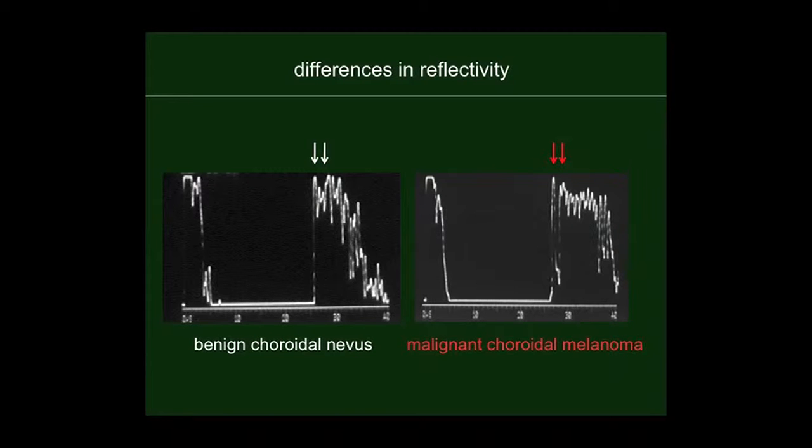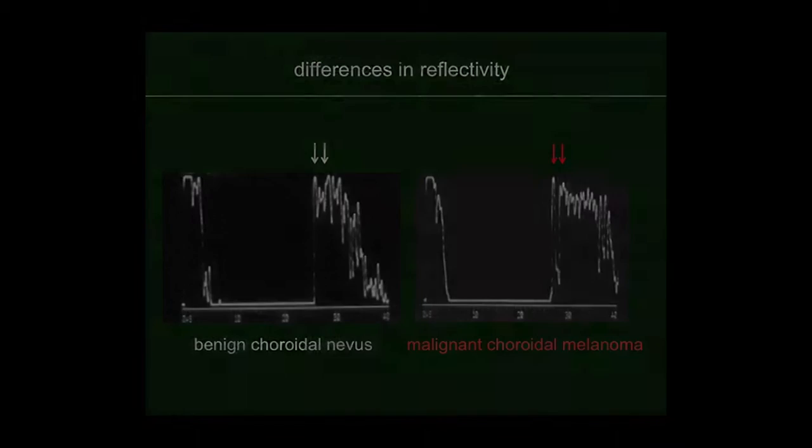In the tumor differential diagnosis with standardized echography, the most frequent case will be that of elevated benign choroidal nevus. You see here in this picture on the left side the nevus having a high reflectivity, whereas the malignant melanoma, equal size roughly, very small tumors, has a low reflectivity, plus is vascularized.